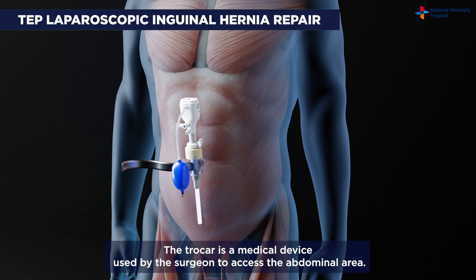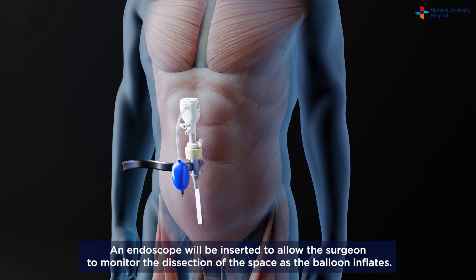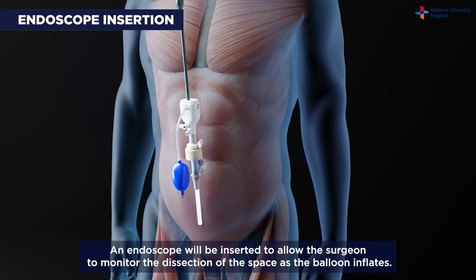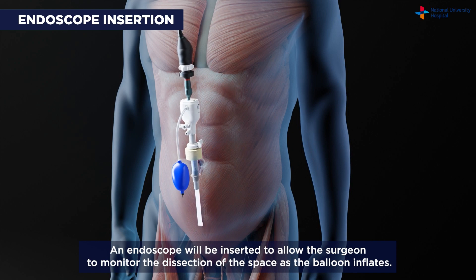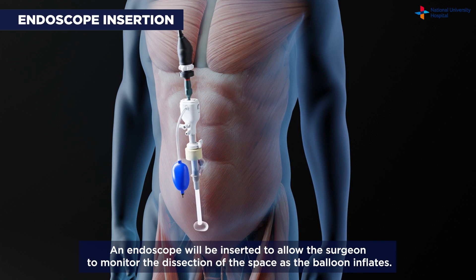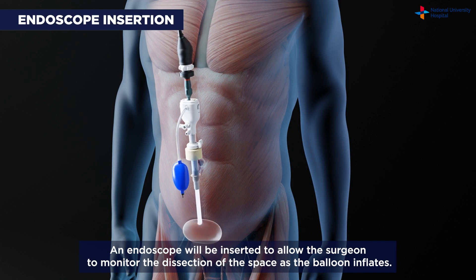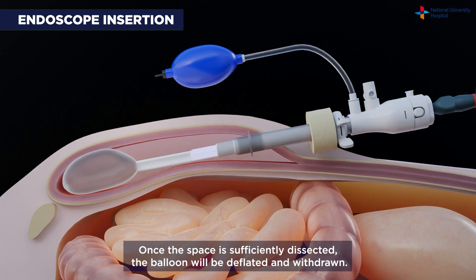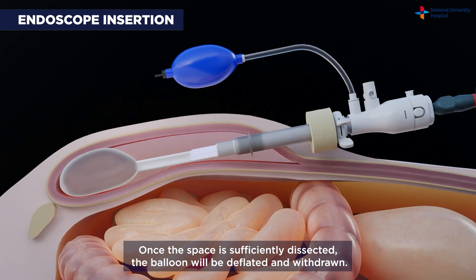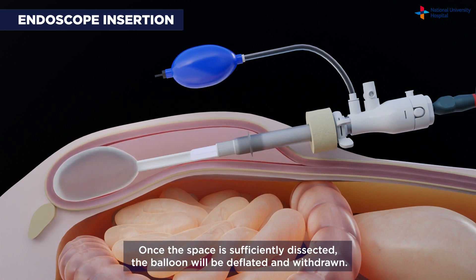The trocar is a medical device used by the surgeon to access the abdominal area. An endoscope will be inserted to allow the surgeon to monitor the dissection of the space as the balloon inflates. Once the space is sufficiently dissected, the balloon will be deflated and withdrawn.